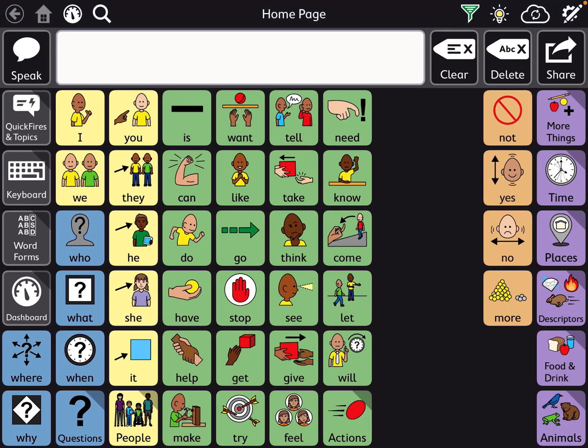This is a video about TD Snap just in general. You can use this for both TD Snap Motor Plan and TD Snap Core First. This is talking about the different features that can change the accessibility and help kids that need some alternative access even within just an iPad.